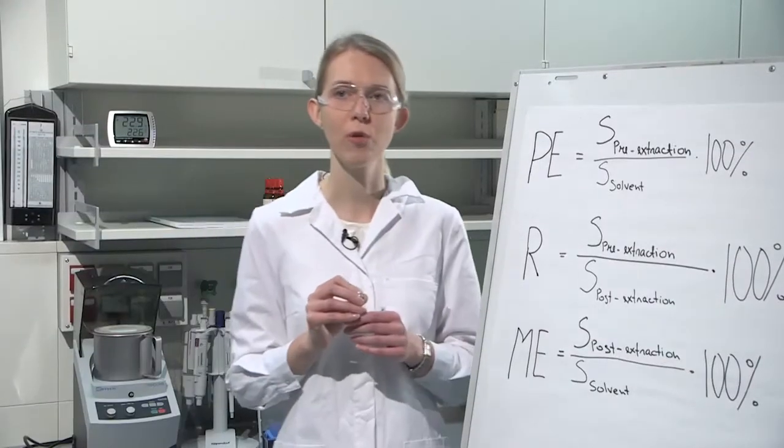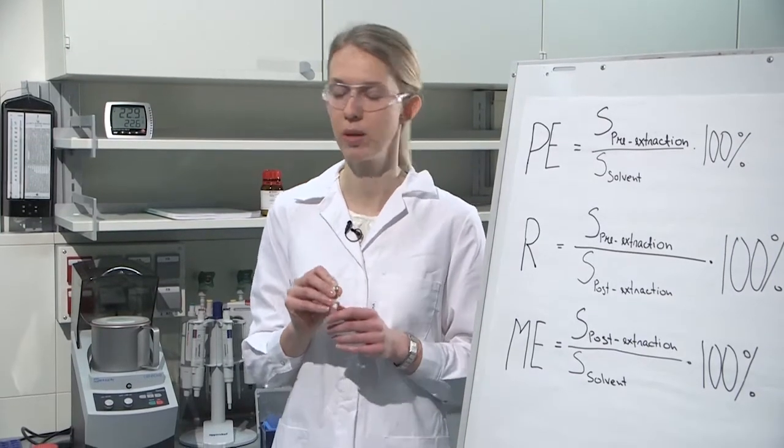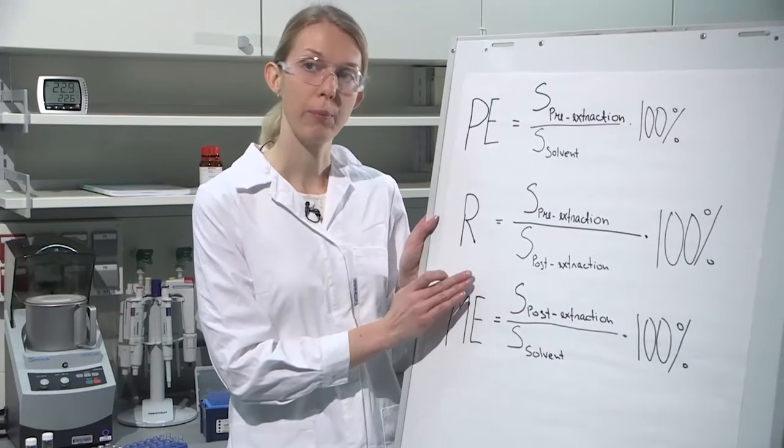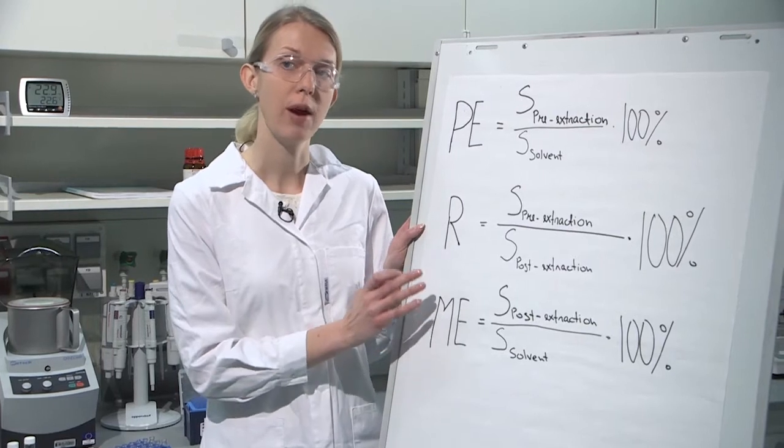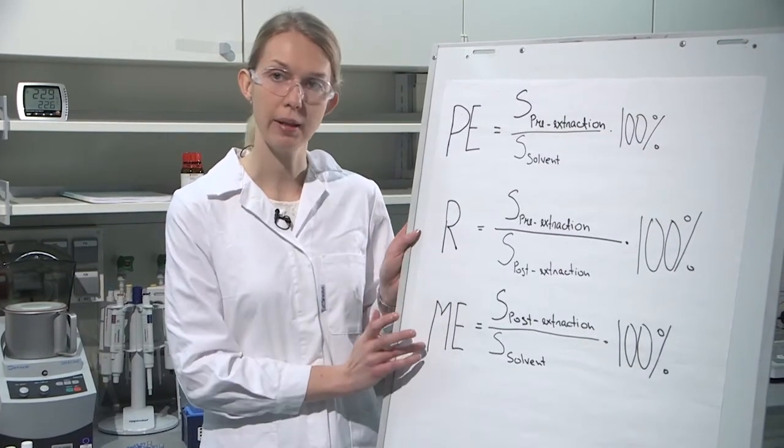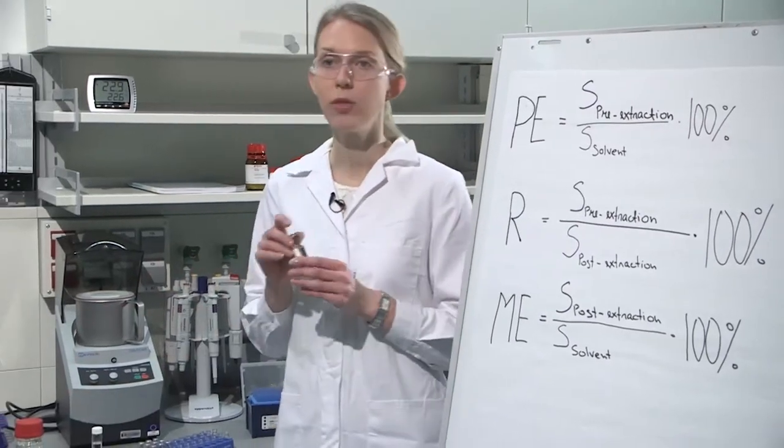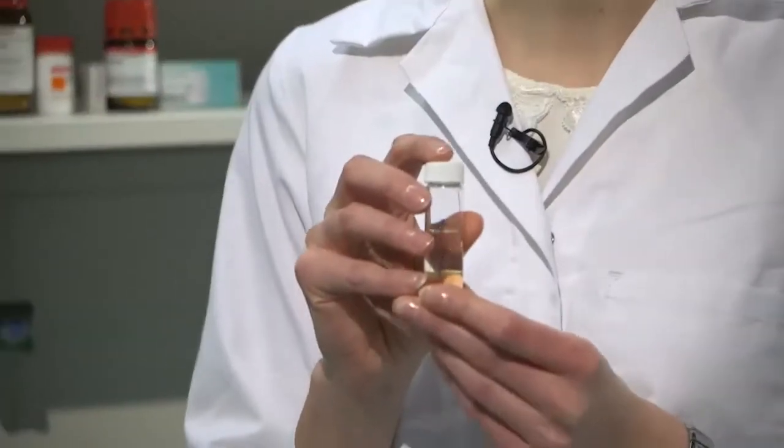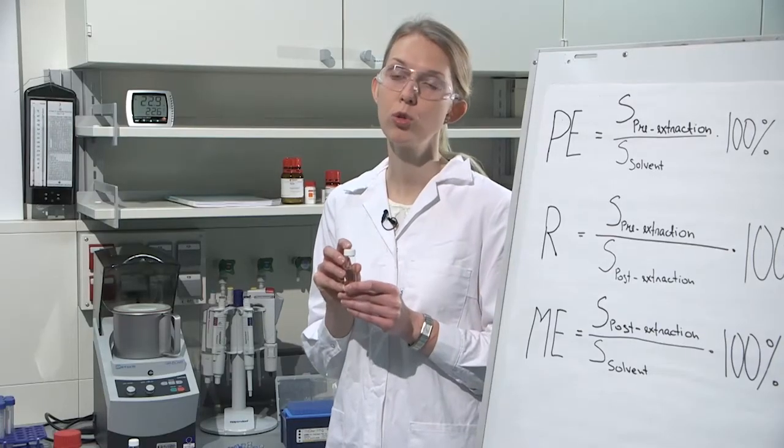So now we have prepared the pre-extraction spiked samples, but we also need to prepare the post-extraction samples that we need for evaluation of the recovery and matrix effect. Therefore I have ready the blank tomato extract that we will spike with our analyte in the same concentrations as we used for spiking before the extraction.